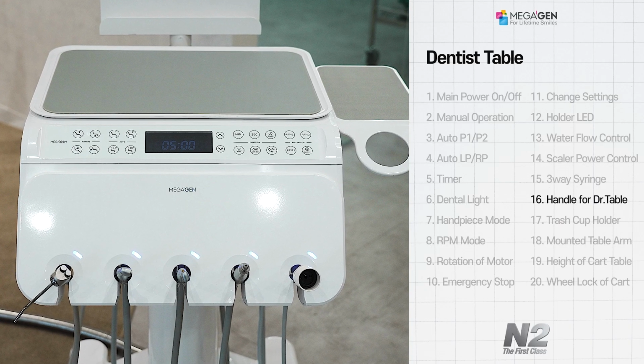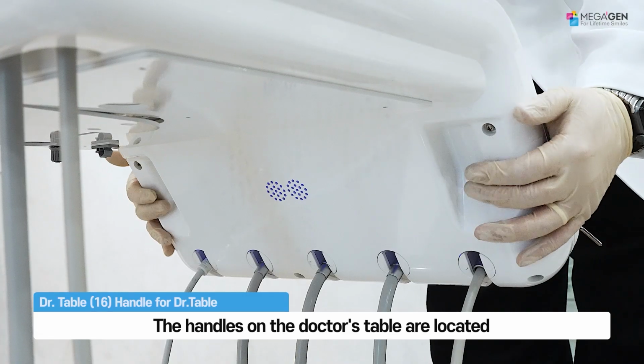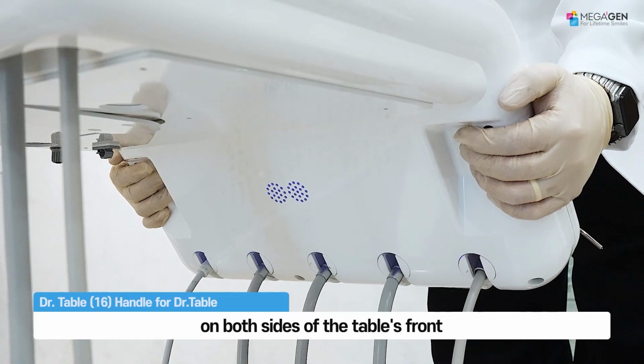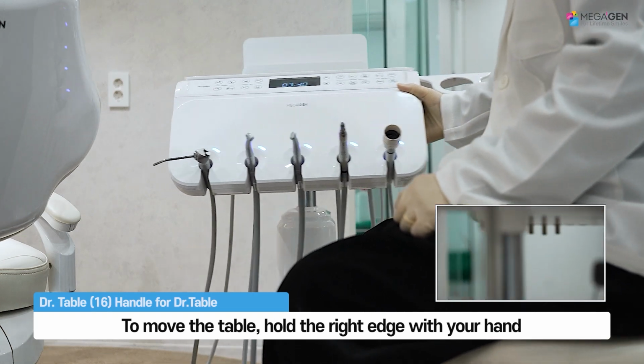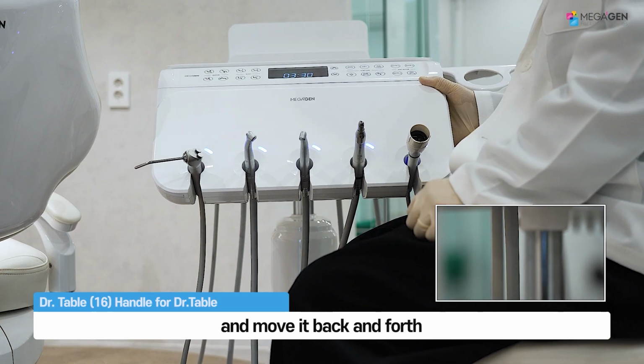Position of the handles on the doctor's table. The handles on the doctor's table are located on both sides of the table's front. To move the table, hold the right edge with your hand and move it back and forth.